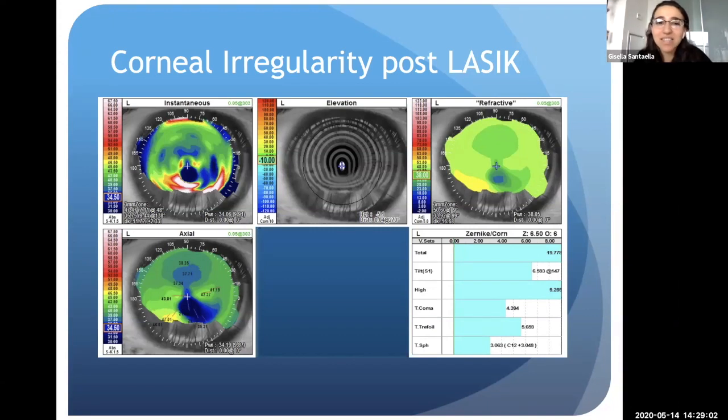Dr. Teitman's asking, have you used topo-guided PRK in post-LASIK ectasia? He has been afraid to ablate more tissue, even though combined with cross-linking. I have. I don't have a huge experience with it. I've done a few cases. And I think it's quite safe to do because you're ablating the flap anyhow, which isn't firmly attached to the underlying stroma. So I don't think you're going to make the ectasia worse. And you're rarely taking off more than 30 to 50 microns of tissue.